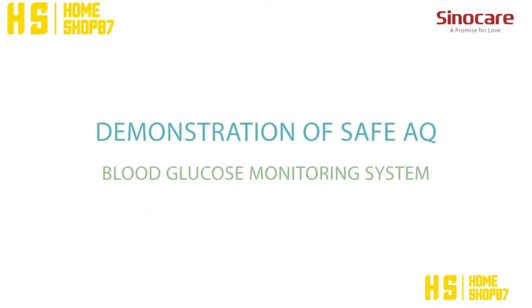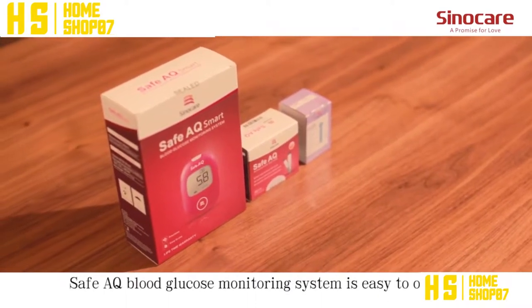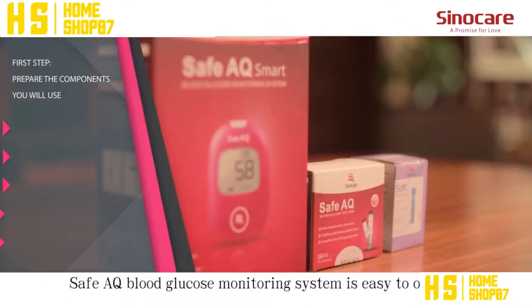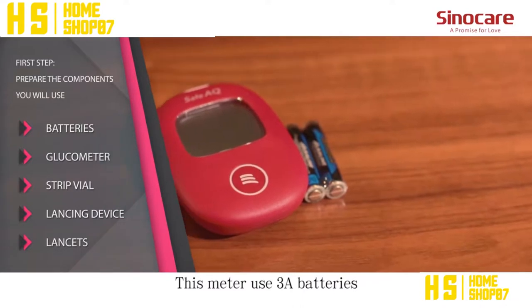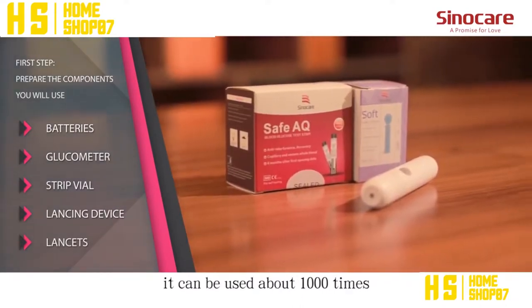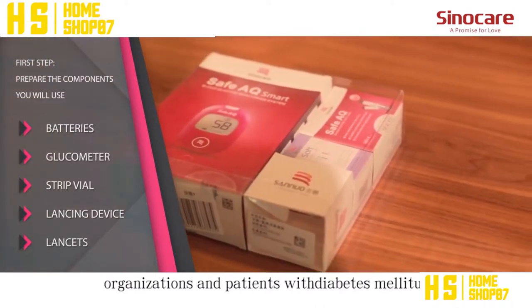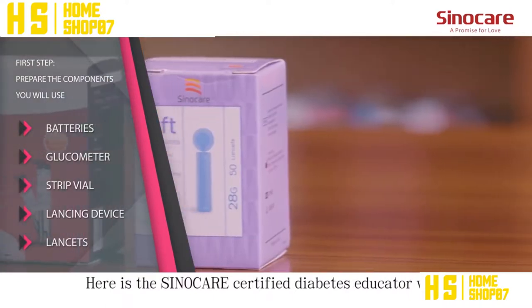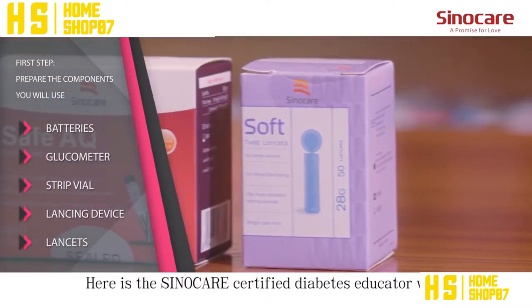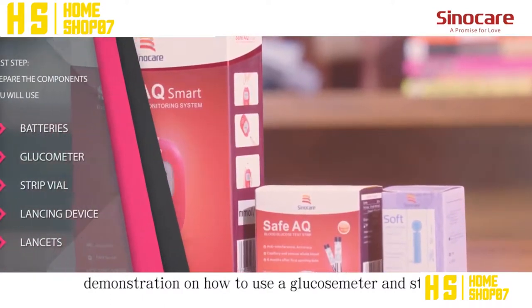Demonstration of SafeAQ Blood Glucose Monitoring System. The SafeAQ Blood Glucose Monitoring System is easy to operate, convenient and speedy. This meter uses 3A batteries and can be used about 1,000 times. It can be applied to medical organizations and patients with diabetes mellitus. Here is the SinoCare Certified Diabetes Educator with a demonstration on how to use a glucose meter and strips.